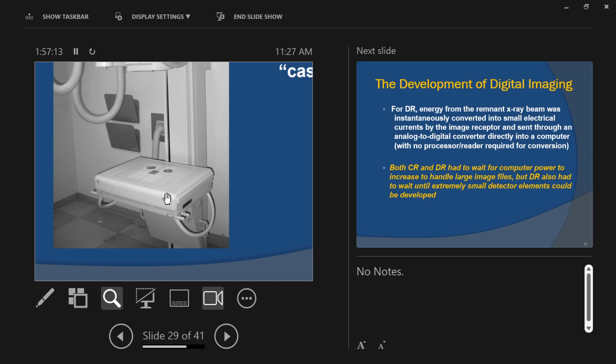Chest X-rays. You're doing 2-view chest X-rays with the patient in their hospital bed, right? You're doing spine studies in the hospital bed. You're figuring it out, right? You're doing everything with a patient who is also, in the ER, can't move, maybe unconscious, right? All these lines coming off of them, you're figuring it out, right? So yeah, you're seeing it right there, just that little bit of it. You're having to kind of improvise a little. So yeah, the X-ray tables, not absolutely necessary, right? They're a huge help for us, but we could do everything without the table, like you just figured out.